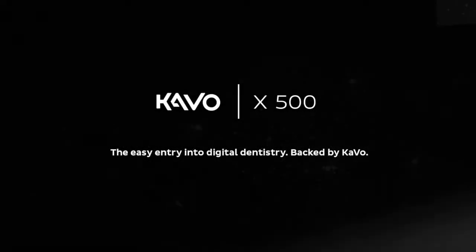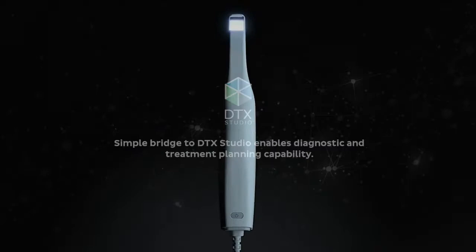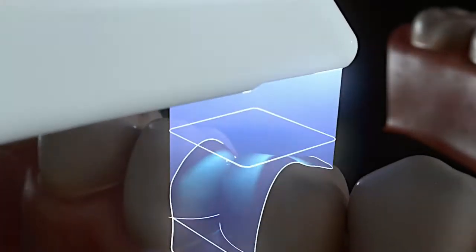Backed by an industry-leading brand known for quality and performance, the KaVo X500 Intraoral Scanner is a simple yet powerful solution, supported by a one-click DTX Studio integration for advanced diagnostics and treatment planning.